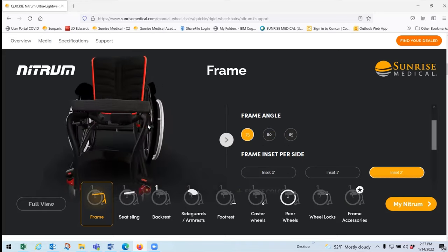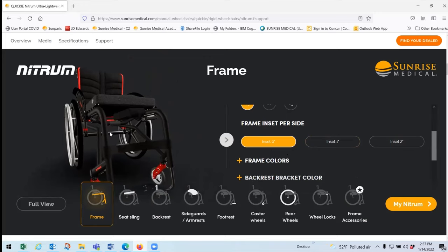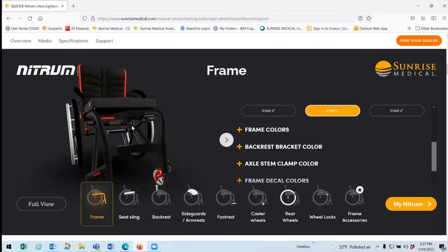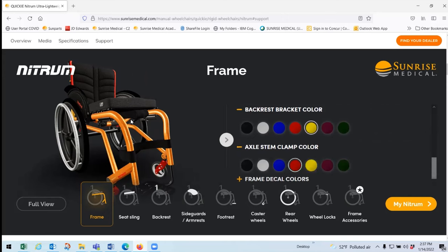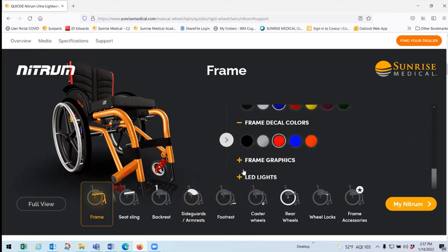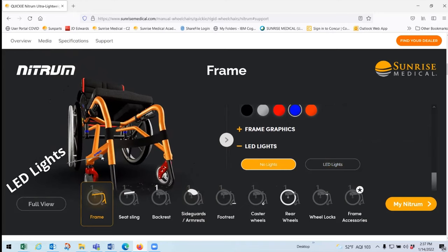You can also play around with the inset — for example, going from a two-inch inset to zero inset or a one-inch inset at 75 degrees. Then you can customize colors: change the frame color, the backrest color, and the decal color, going wild with different combinations to match your favorite team or personal preference. You can also add LED lights to see their position on the chair. The Nitrum is the only chair in North America with a 3D visualizer that lets you fully configure your chair online.